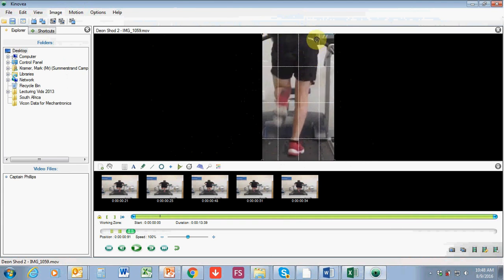Okay, so I can see his hips are here. I want to try and make some kind of note of where his trochanter is. So again, wrong one. Need the angle measure. Okay, so again, I would need a level line. So I want to make sure that that's really nice and straight. Not quite happy with that yet. There we go. That's nice and level.